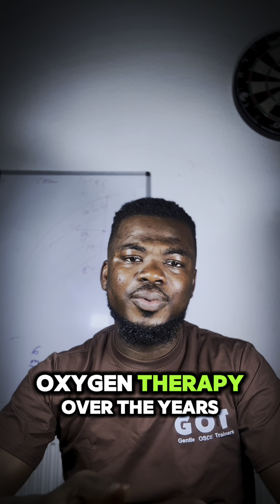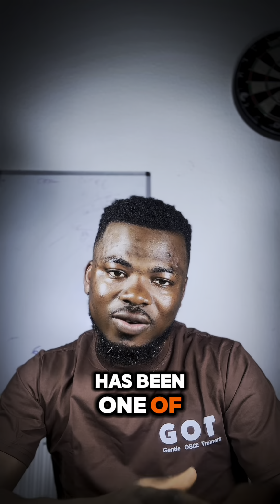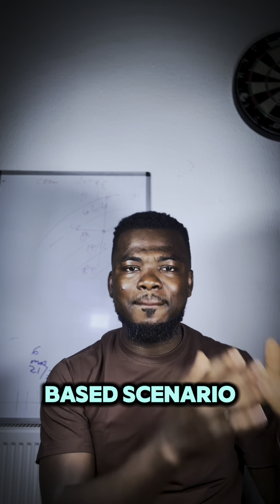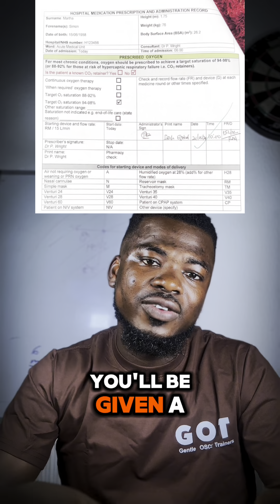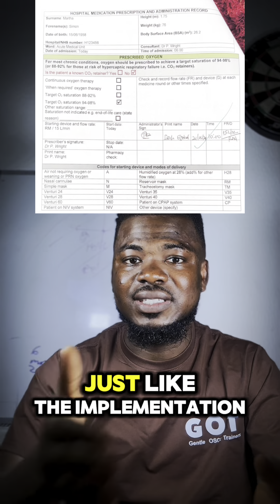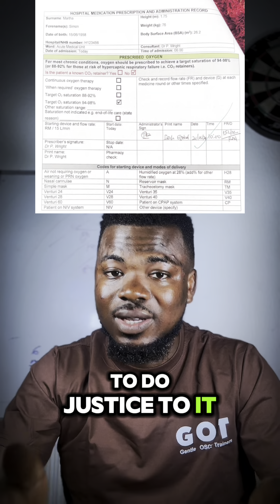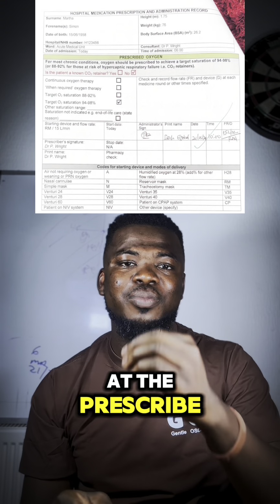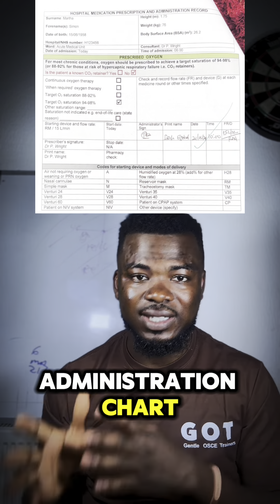So oxygen therapy over the years has been one of the clinical skills in OSCE. It's treated as a hospital-based scenario. So during this station, you'll be given flipping pages of prescription, just like the implementation, and your job is to do justice to it. So you'll find the prescription of oxygen administration at the prescribed oxygen section of the medication administration chart.